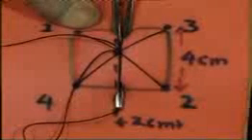The free end of the suture is then pulled deep to the central knot with the help of a needle holder or an artery forceps. It is taken around the posterior part of the X and two or three more throws are given to complete the knot.